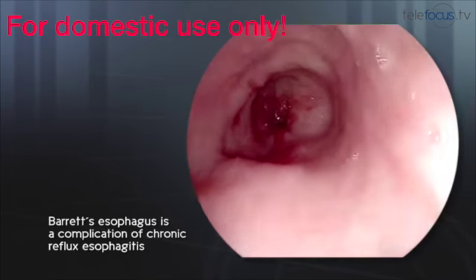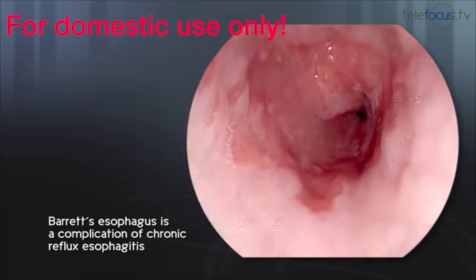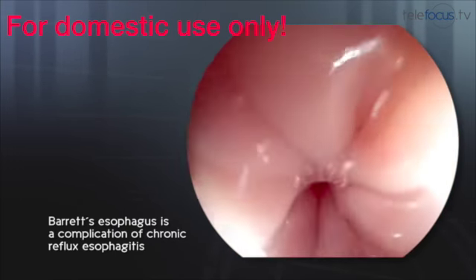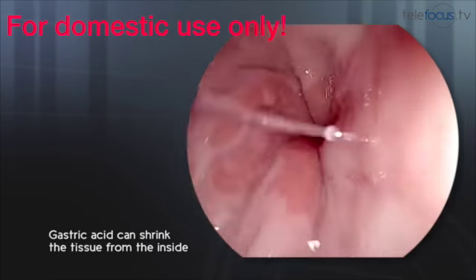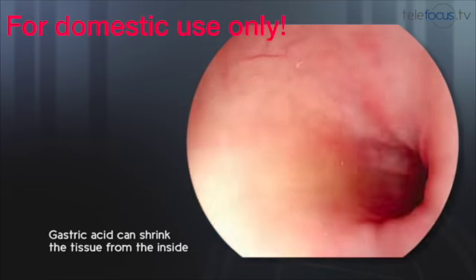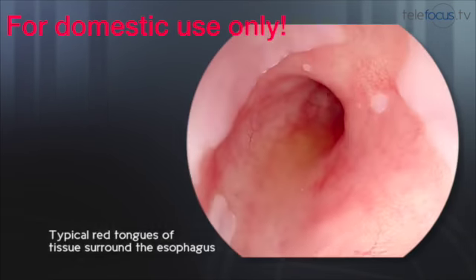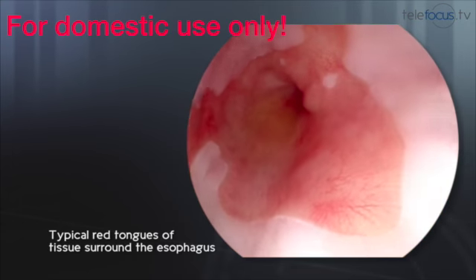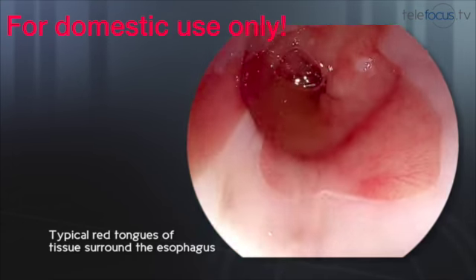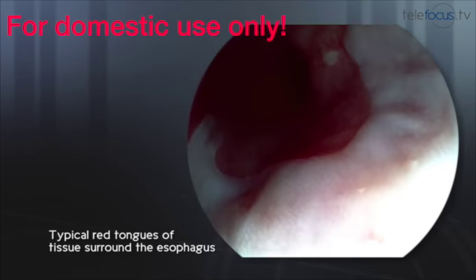A complication of chronic reflux esophagitis is Barrett's esophagus. A chronic reflux can degenerate the tissue of the lower end of the esophagus and can shorten it from the inside. In this process, characteristic red tongues surround the complete circumference of the esophagus. Although only in rare cases malign tumors develop out of a Barrett's esophagus, the disease should be monitored endoscopically at a regular basis.